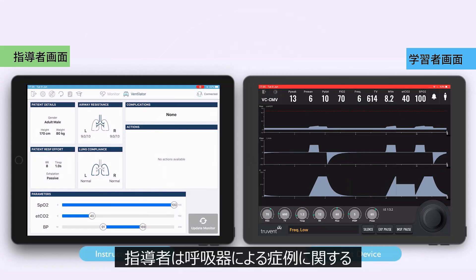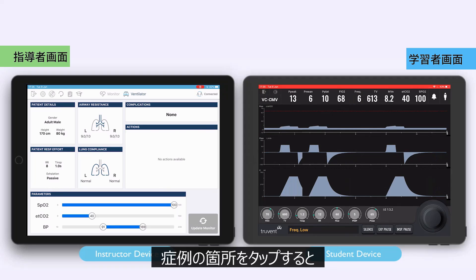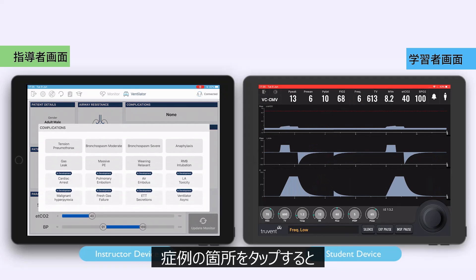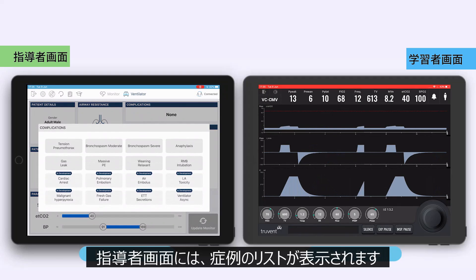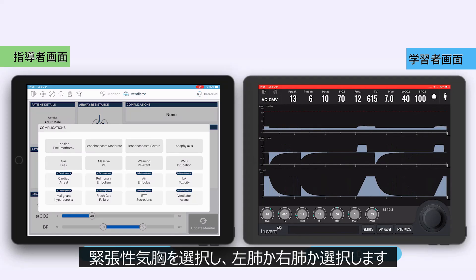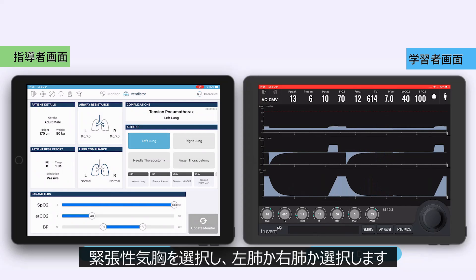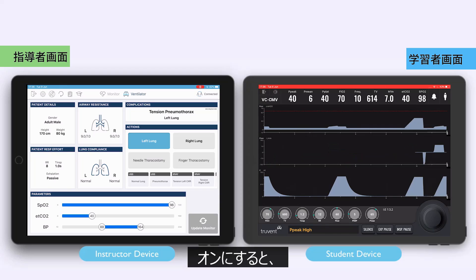The instructor can introduce learning objectives relating to complications of mechanical ventilation by tapping on the complications tile. The instructor is presented with a list of available complications. For example, to activate tension pneumothorax, all the instructor has to do is select tension pneumothorax and then define whether it is the left or right lung.